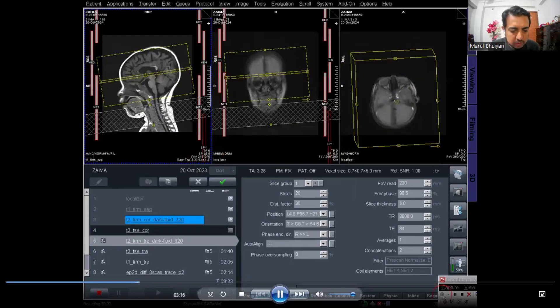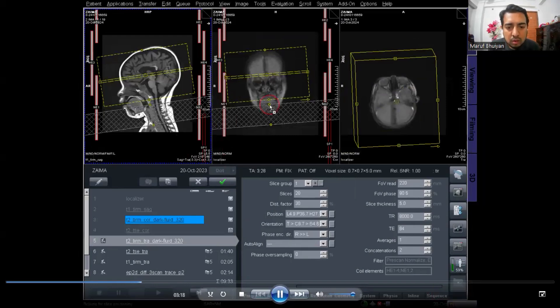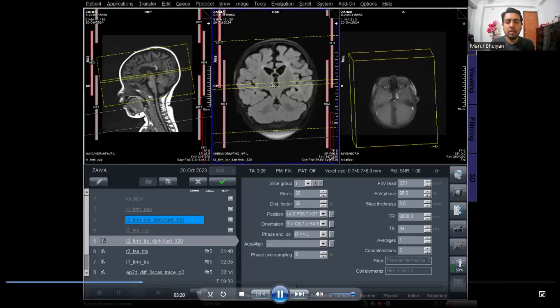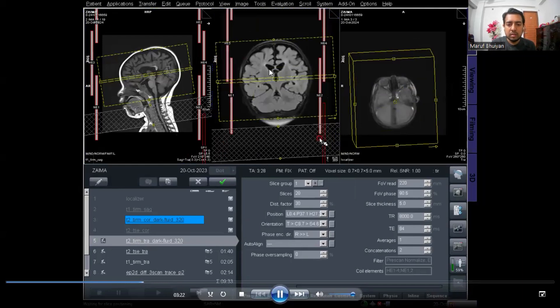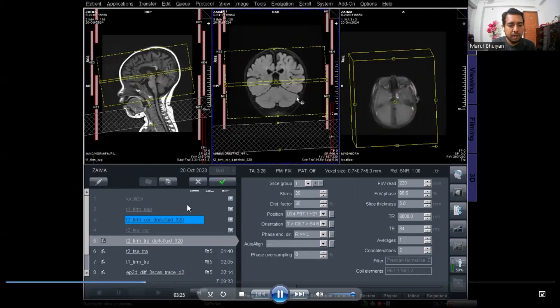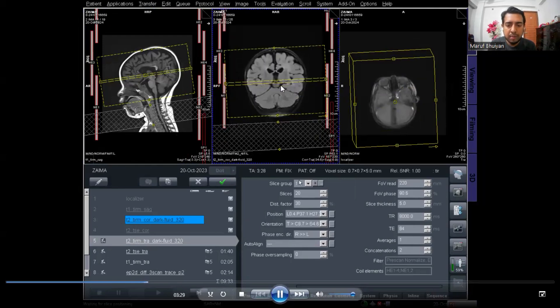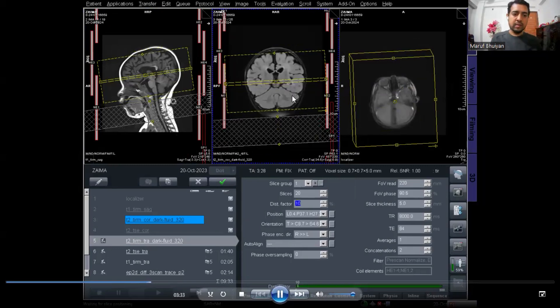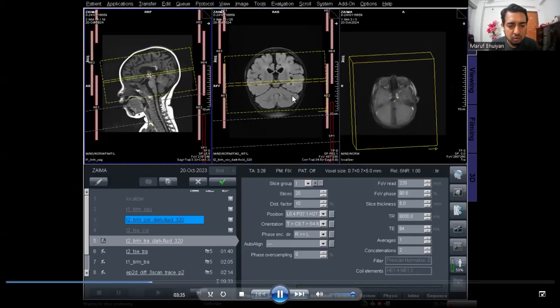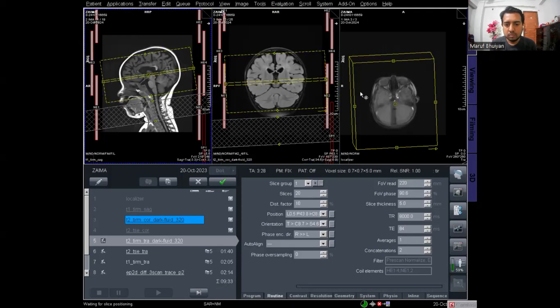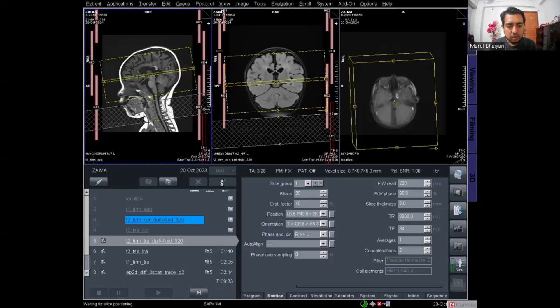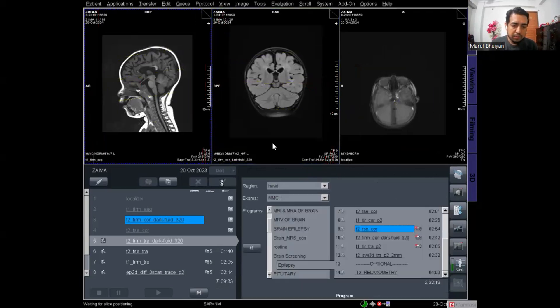Now I am planning the T2 transverse dark fluid for the whole brain. After planning, click Apply. This is the FLAIR coronal for epilepsy — that is the third protocol, T2 FLAIR coronal. I am now planning the T2 axial dark fluid for the whole brain. After planning, click Apply.